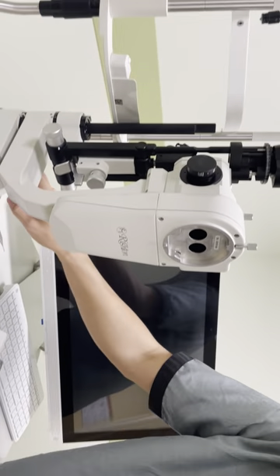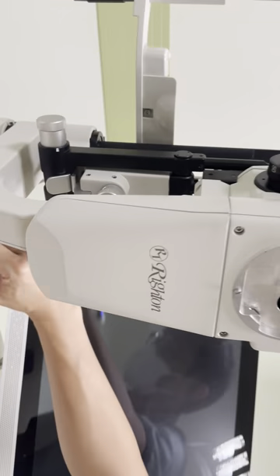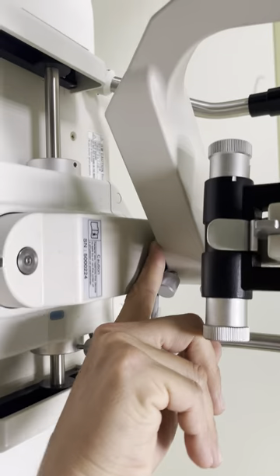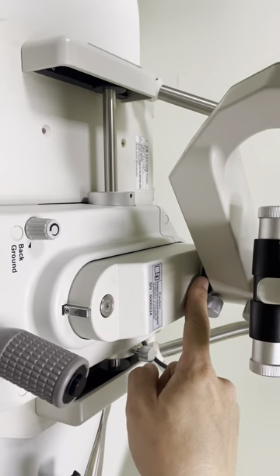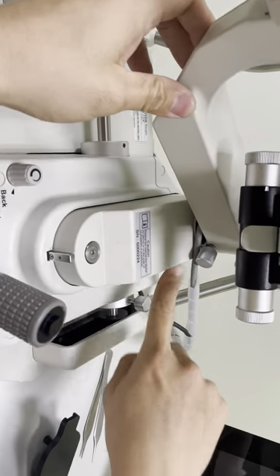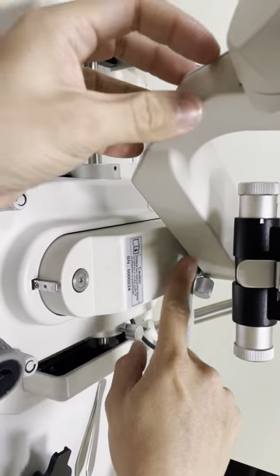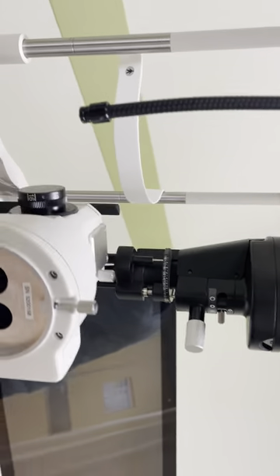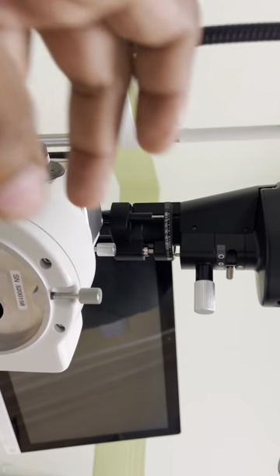Then another cable — make sure when you open there is a slot here. Don't mess the slot because there are two sides: on the right side and on the right side. Just loosen this a bit, detach, and only take out the cover.